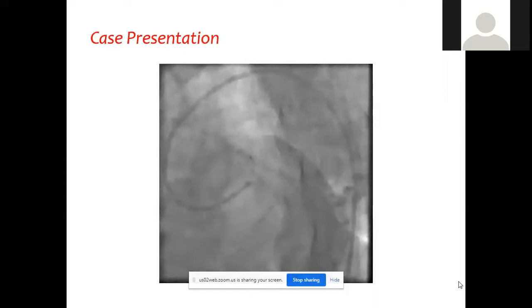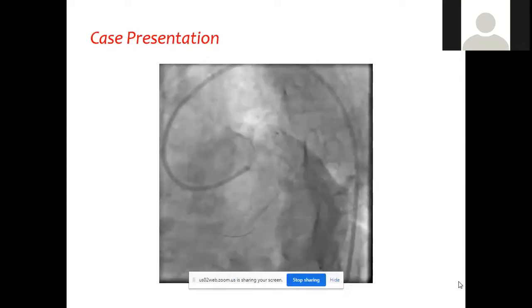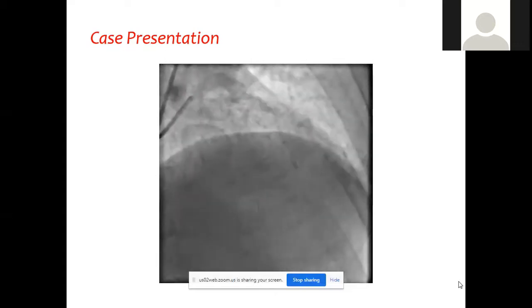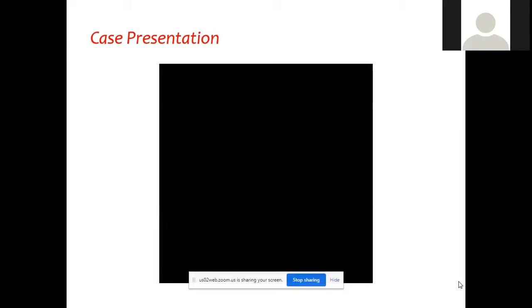The POT segment should, of course, not exceed the carina of the bifurcation. Then we attain TIMI 3 flow within the two vessels. As you see here, the two vessels have adequate TIMI 3 flow, and no stent is needed in the diagonal branch.